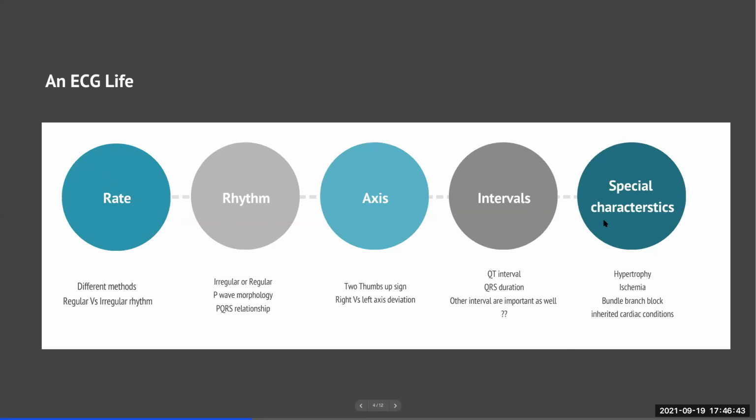I always say that in ECG, there is never a spot diagnosis as in medicine. There are very few ECGs where you can accurately diagnose. Even experienced electrophysiologists take 5 to 10 seconds before they decide what this ECG looks like. And unless you have a method to it, it's very difficult to understand.